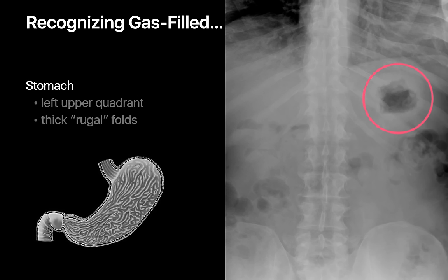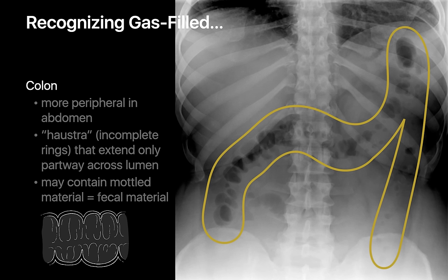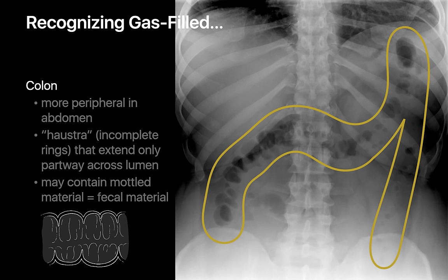Gas inside the stomach can be recognized by its location in the left and/or midline upper abdomen and the thick rugal folds outlined along the margin of the gas pocket. Gas inside the colon can be recognized by its more peripheral distribution and repetitive transverse bands partially interrupting the gas column, which correspond to the colonic haustra. Mottled material corresponding to stool is also helpful in identifying the colon. Gas inside the small bowel can be recognized by its more central distribution and faint, tightly packed transverse bands corresponding to the valvulae conniventes, which are thinner, uniformly spaced, and closely spaced compared to colonic haustra.